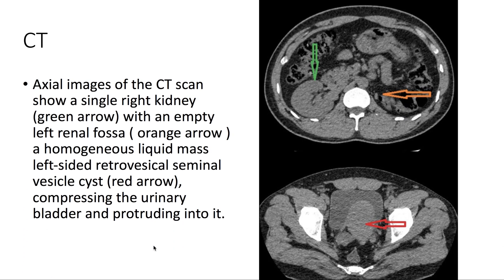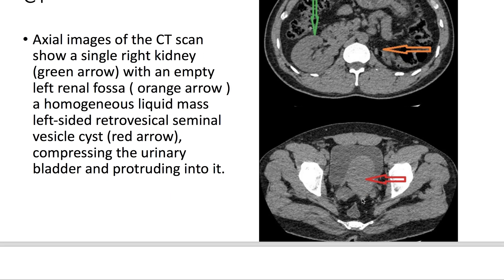On CT, we see a single right kidney with an empty left renal fossa. There's also a homogeneous left-sided retrovesical seminal vesical cyst compressing the urinary bladder and protruding into it.